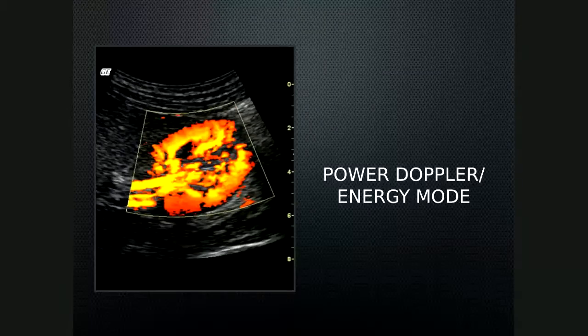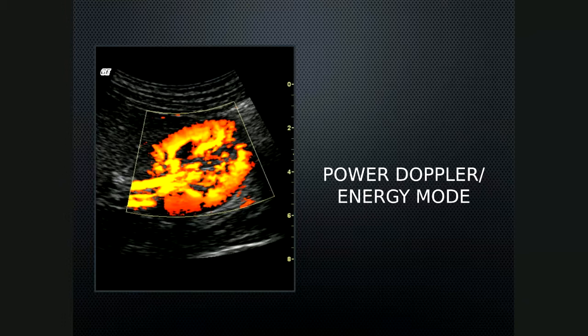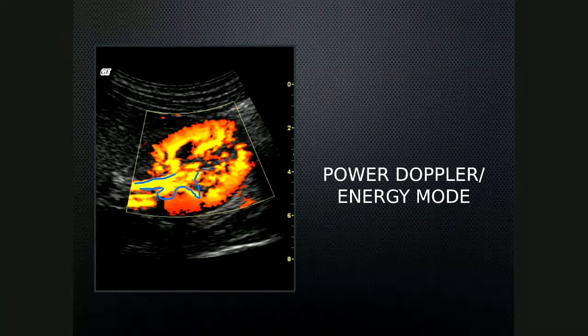See, there should be sort of a map, but there's no directional information. There's no information other than is there flow. So these lighter areas here are real bright areas. That means there are more red blood cells in those particular areas. Whereas on the edges, the darker shades there indicate that there's not very many red blood cells, or a very low concentration.